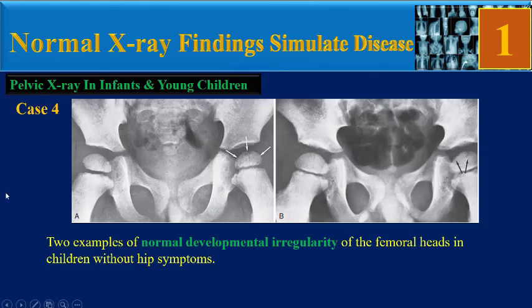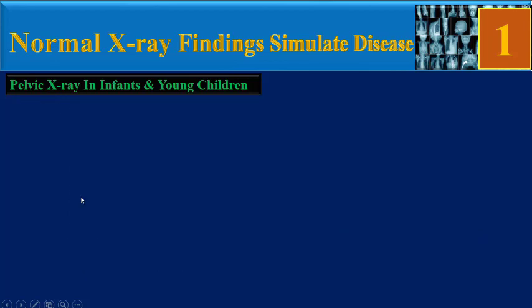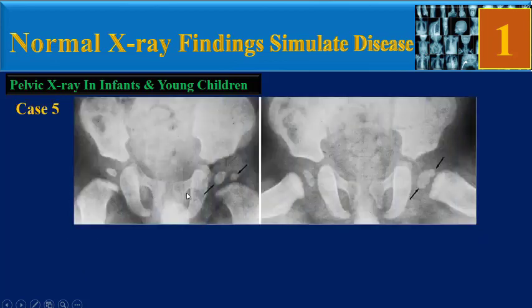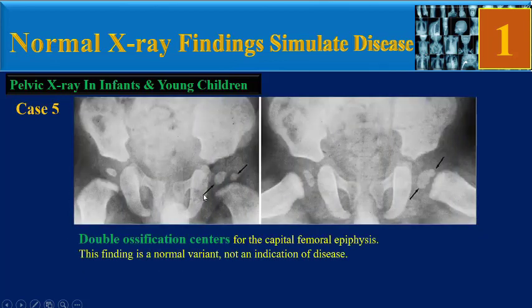Case 4: two examples of normal developmental irregularity of the femoral heads in children without hip symptoms. This is a three-year-old boy, and this one is a four-and-a-half-year-old boy.